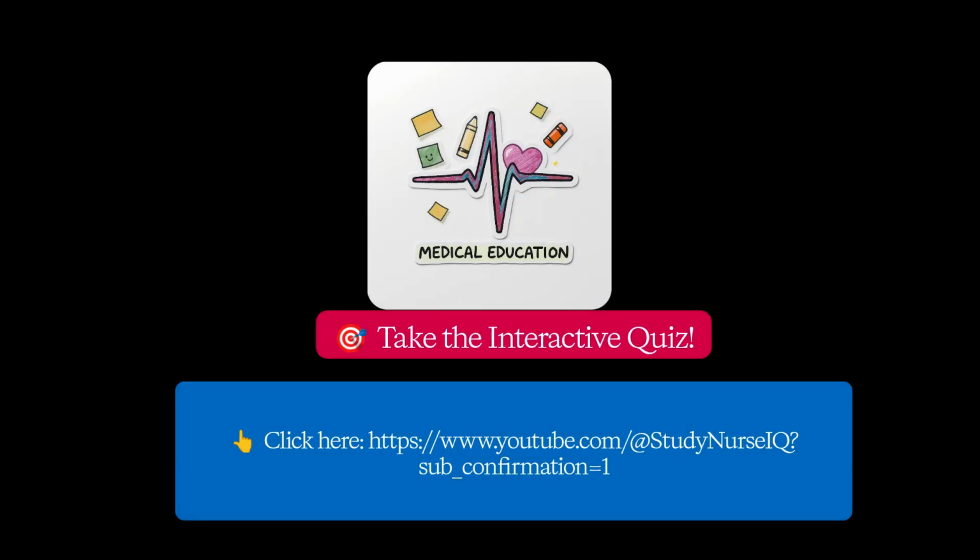We've covered the essential fundamentals of EKG interpretation, from understanding basic waves to recognizing critical patterns.